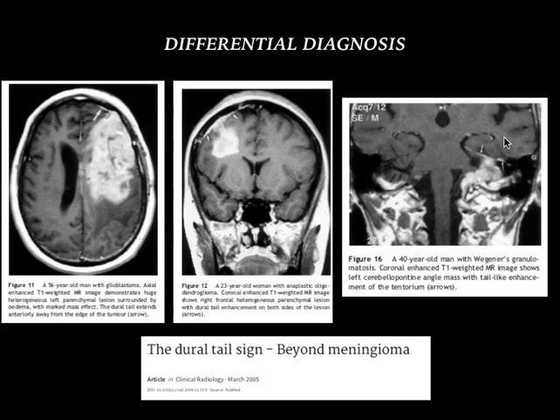This is again a case of large glioblastoma showing intense heterogeneous enhancement with dural tail along the left frontal convexity. And this is a case of anaplastic oligodendroglioma, which is an intra-axial lesion again showing enhancement and thickening of the dura.